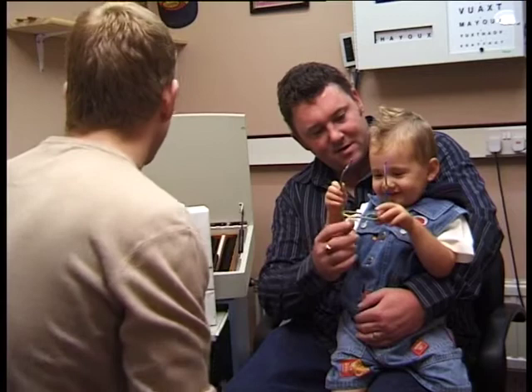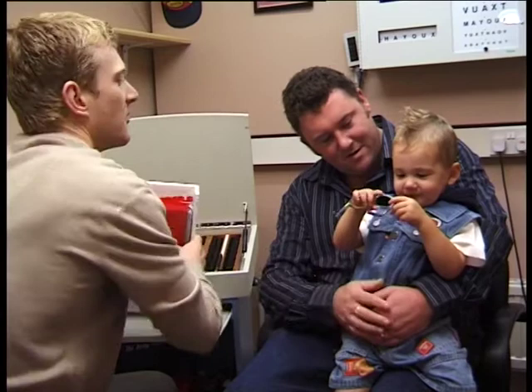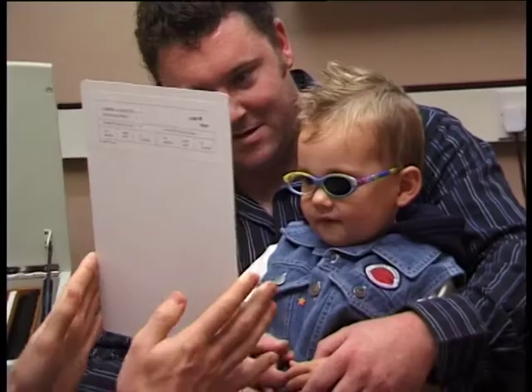So far we've seen visual acuity measured binocularly, but of course it's also important to measure vision in each eye in turn. Here's Cameron carrying out the test with Rhys.